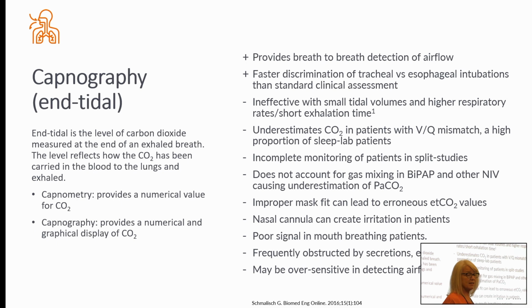Of course, it is continuous, so it overcomes that big limitation of your blood gases. It also gives you a nice breath-to-breath waveform so that you can really see that it's picking up. And if any of you have worked in ICUs, that's particularly important because it's going to tell you immediately if you're intubated and if the patient accidentally extubates. You don't have to worry about that, hopefully, in your sleep labs.